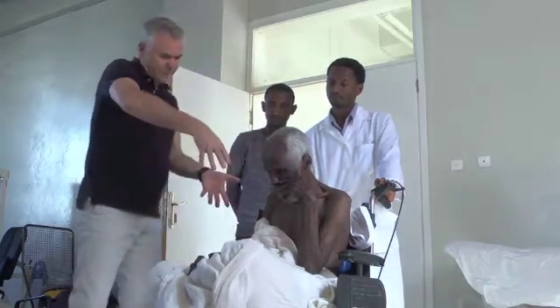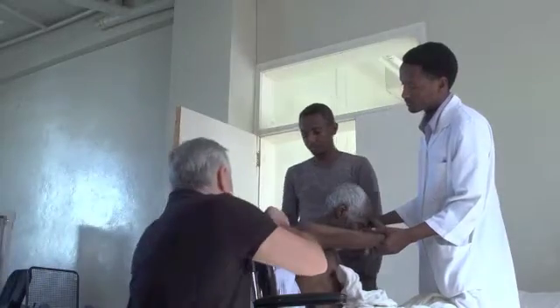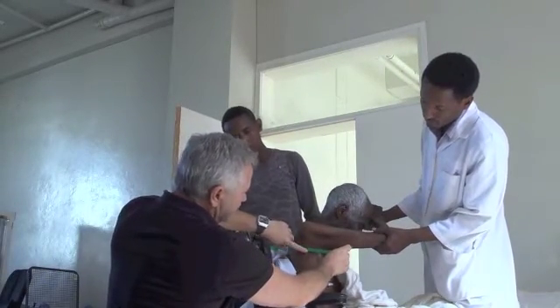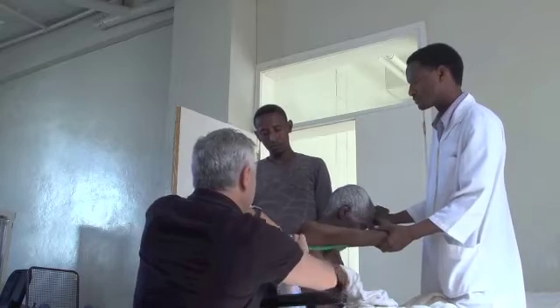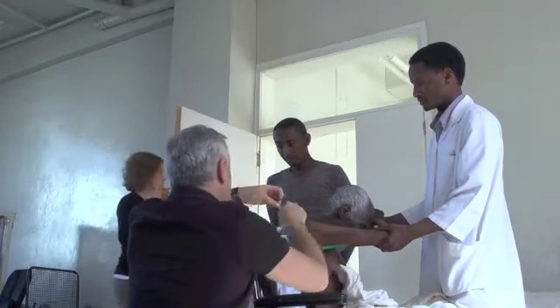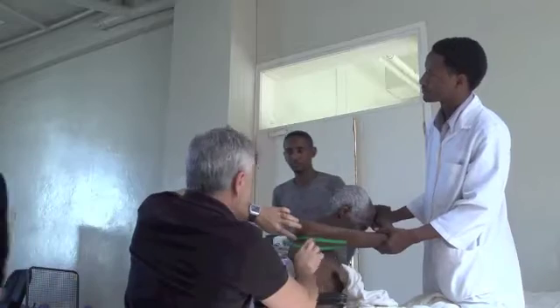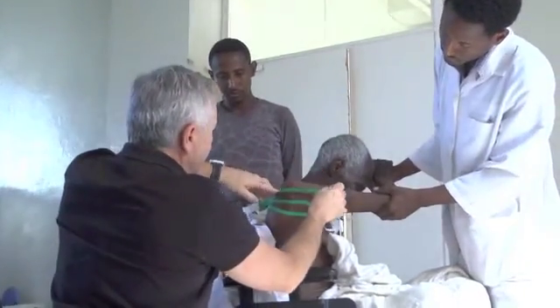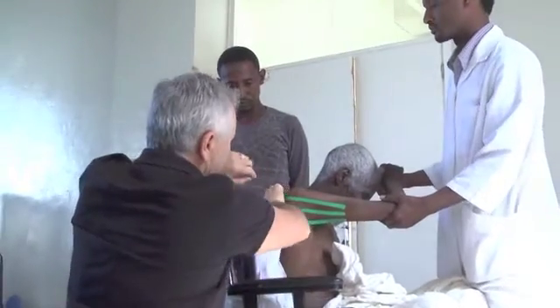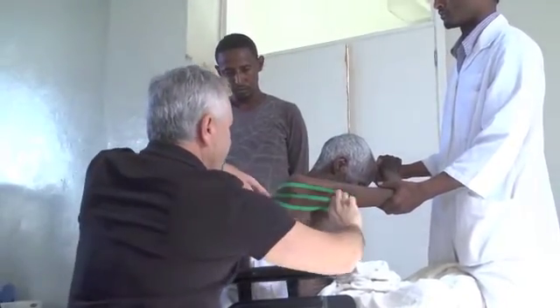Let's get the patient to rotate hands. Cover the posterior aspect of the shoulder. The first one — we're going to go down towards the posterior elbow, posterior armpit corner, and apply that. Second one, we're still going to apply straight. Third one, still straight, leaving one to two centimeters between one tape and another. So we want to cover the whole surface area posterior to the shoulder.